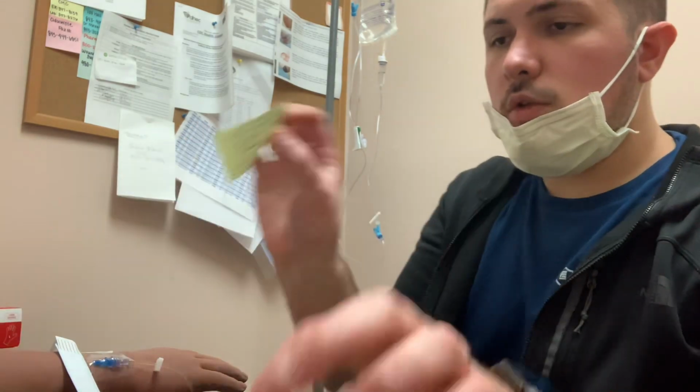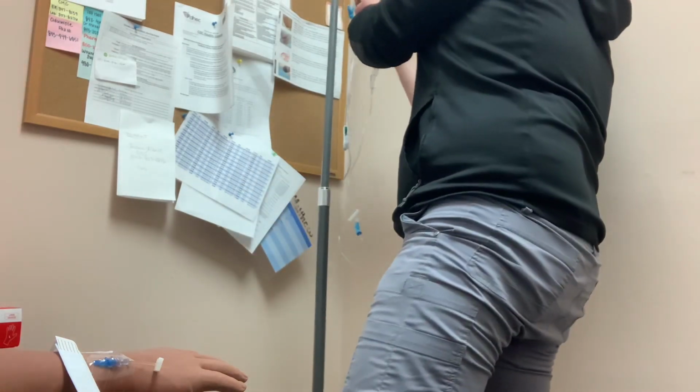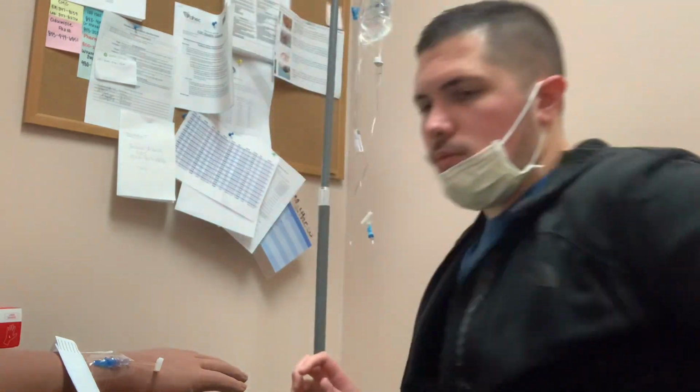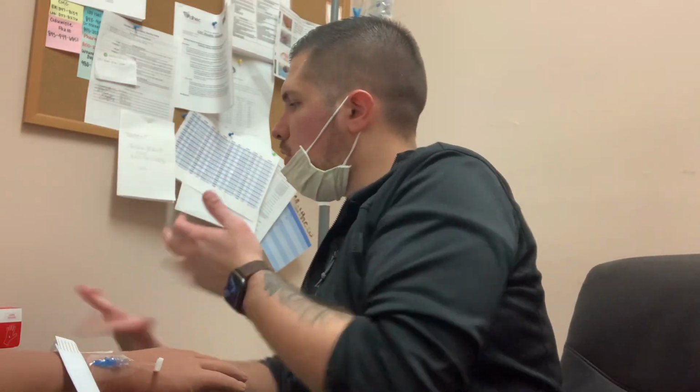My signature, and we will put the rate on it as well, which is 125 mLs per hour. And we're going to label our bag. Alright, do hand hygiene.